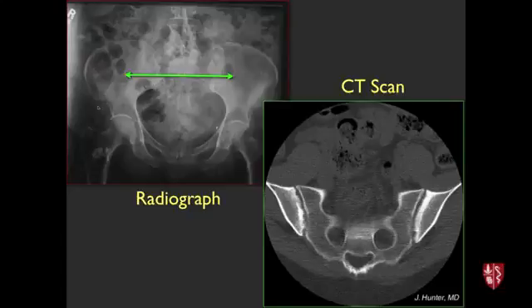But if the situation is, again, that patient in the emergency room that fell, and there's a high index of suspicion for a fracture and one doesn't see something on the X-ray, then CT is a good next step because it's fast and it's very accurate for detecting fractures.